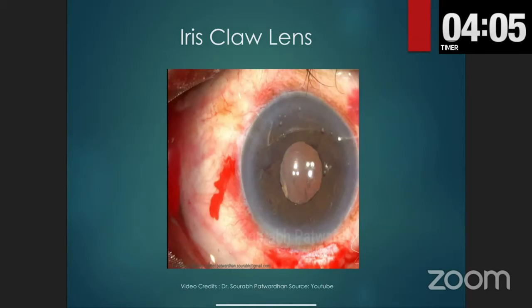And post-operatively, there are chances of having iritis, and optic capture is a little bit higher in this technique. So it takes a little bit of time to really understand and do this. So this video I got.